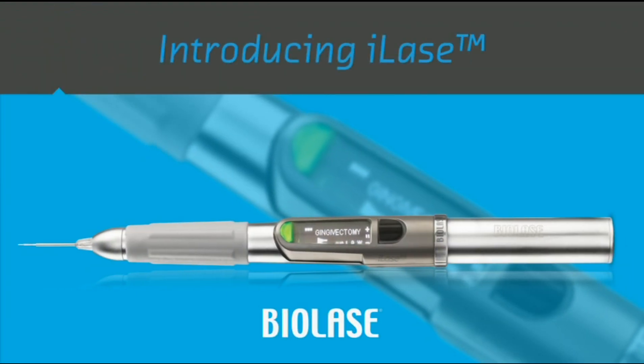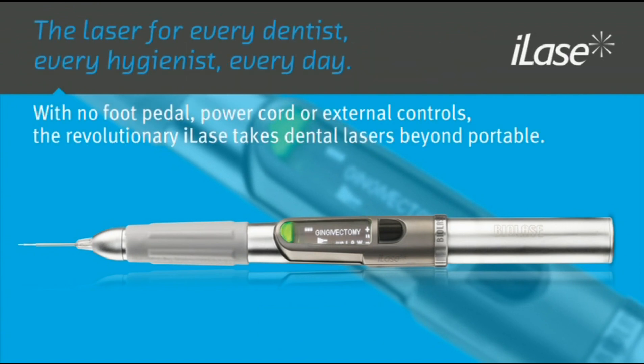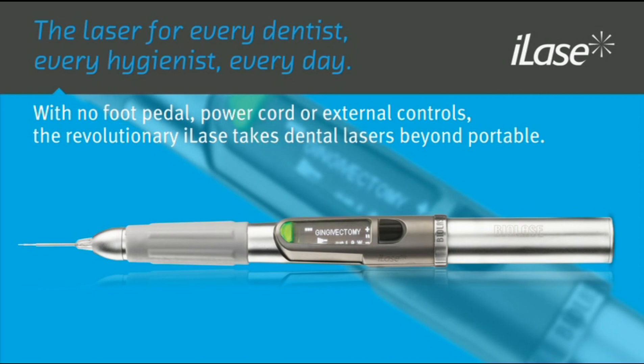Congratulations on purchasing the iLase from BIOLASE Technology, the world's first personal dental laser for soft tissue and hygiene procedures. This video will provide an overview of how to set up and operate the iLase. For complete details on the iLase, please refer to your user manual.